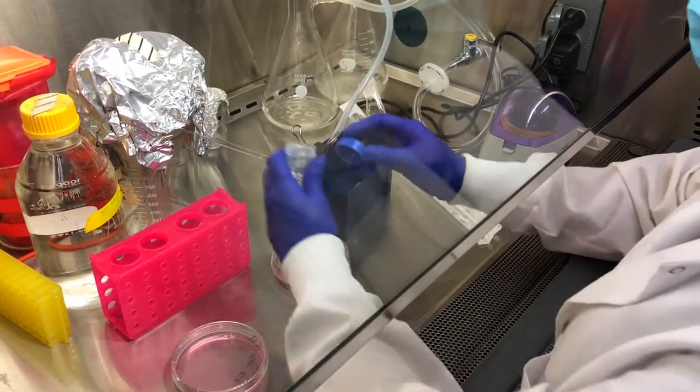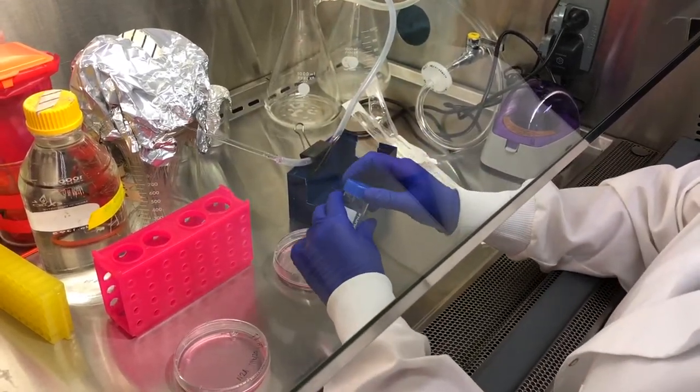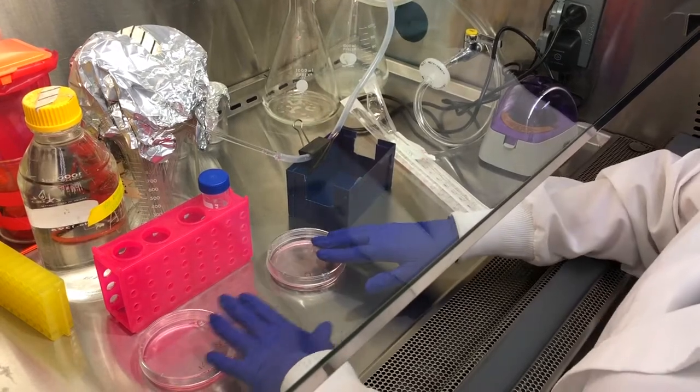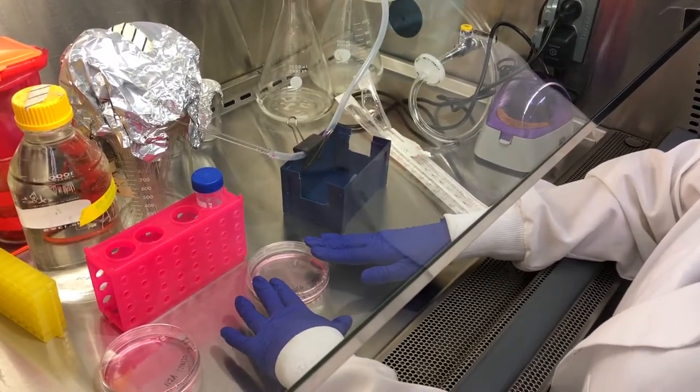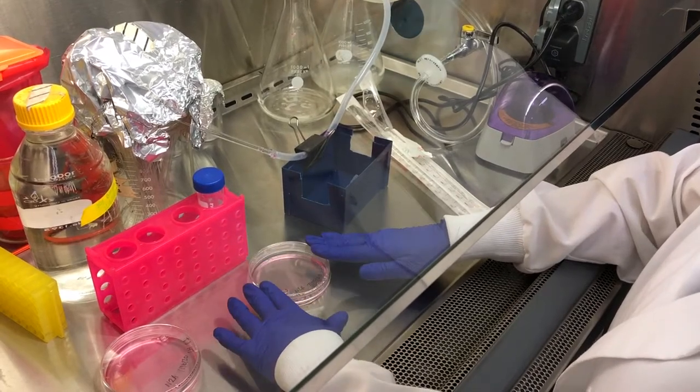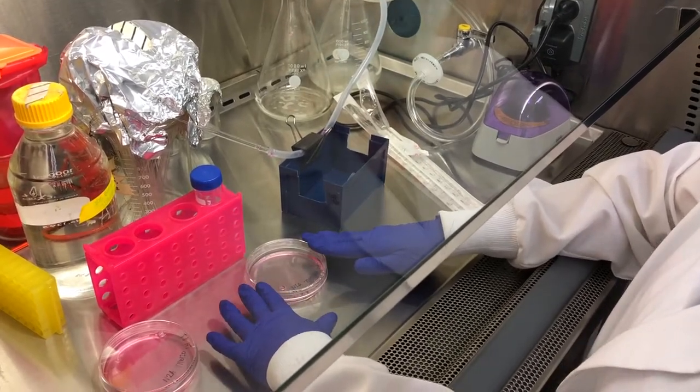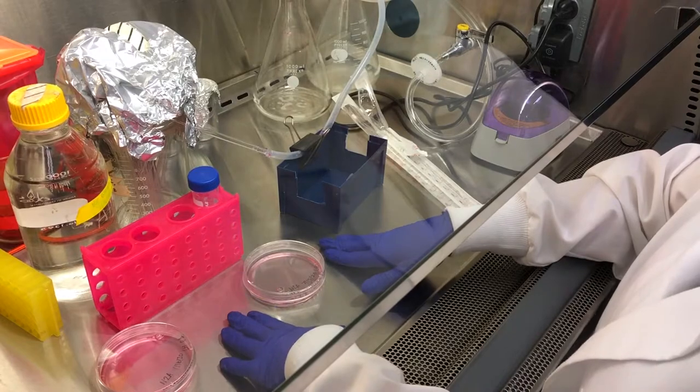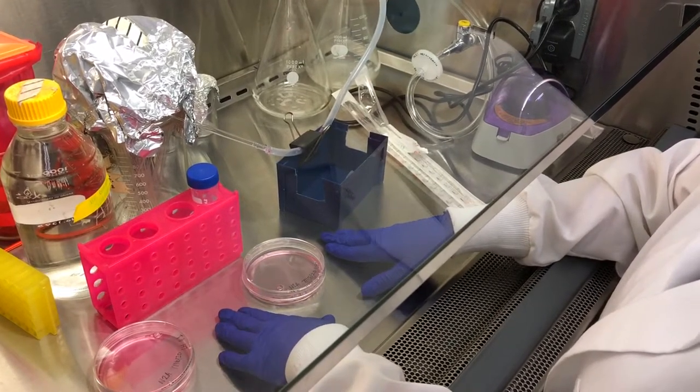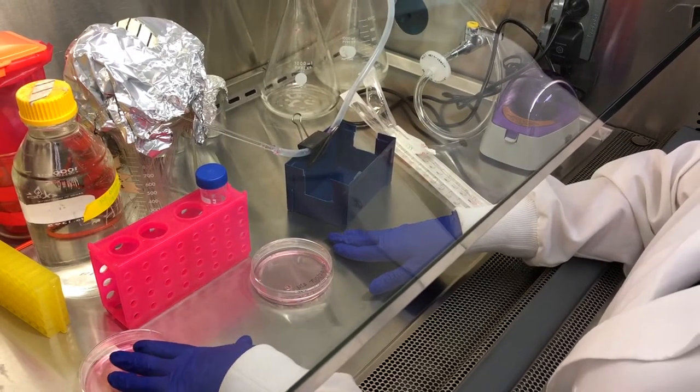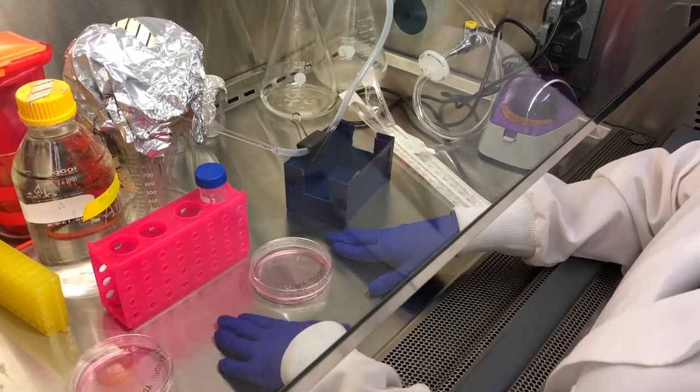There are many different ways you can passage your cells. And this is just one example. The remaining cells in the original plate can either be discarded, or you can transfer the remaining five mils into a new tissue culture plate with five mils of fresh media. That way you'll have two plates of newly passage cells.